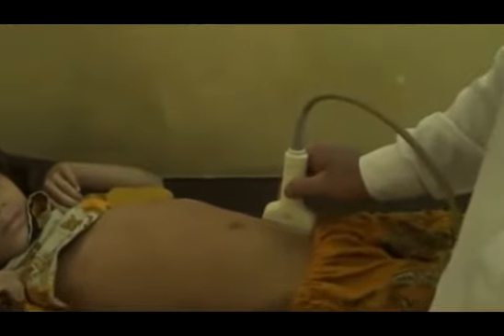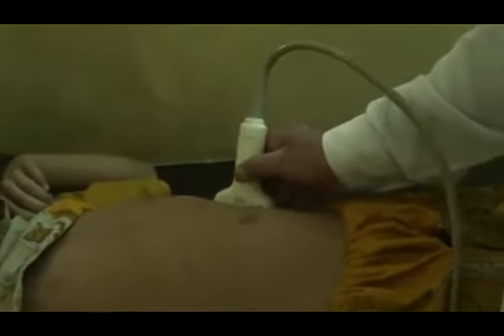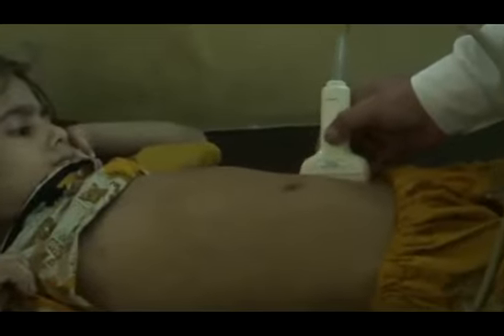You can see that I am here now, and I can see the lower end of the tubular structure. When I move the probe in this direction up to this level, the tubular structure persists from here down up to the left side of the pelvis. Now let's see on the ultrasound machine.